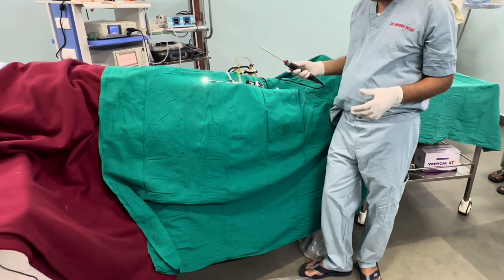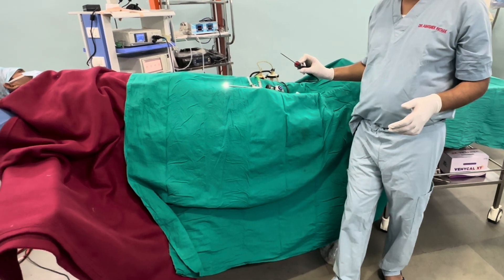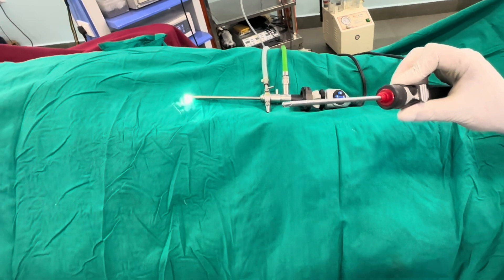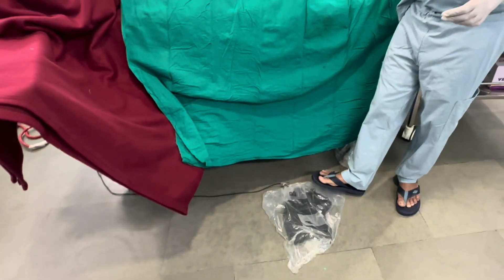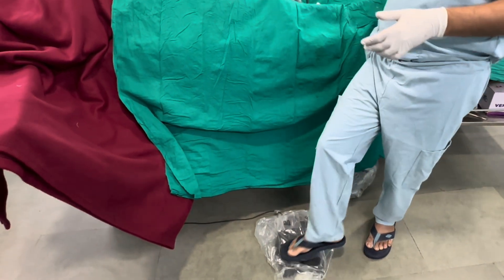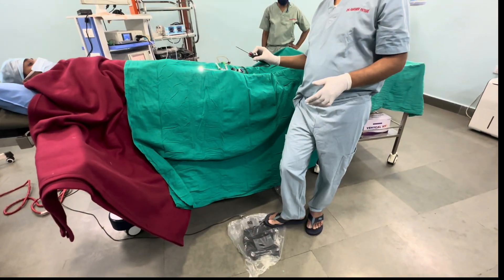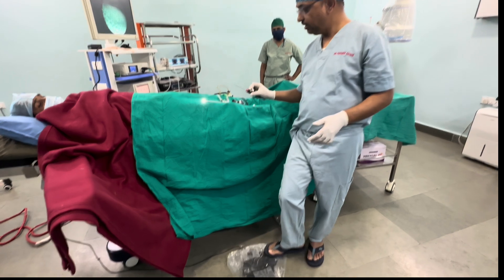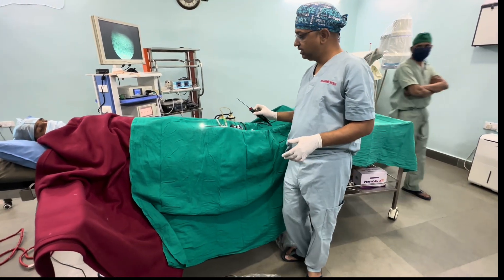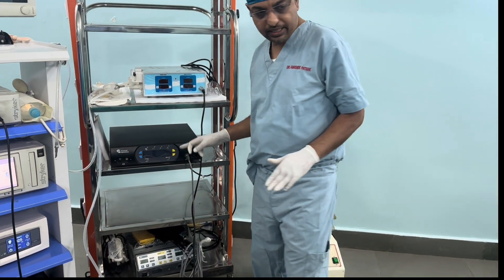This shaver handpiece does not have hand control, so we use a foot operating switch. Oscillating mode is the most common mode used in arthroscopy and is used for debridement. Using the foot pedal, we can change between oscillating, forward, and reverse modes as demonstrated.